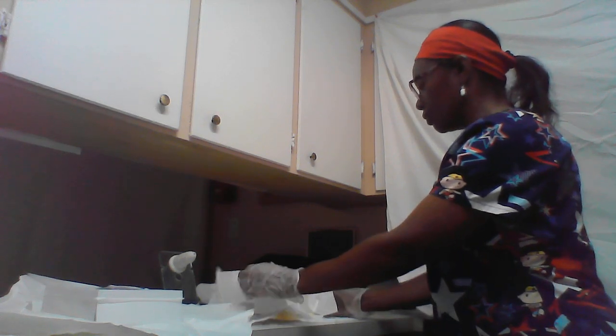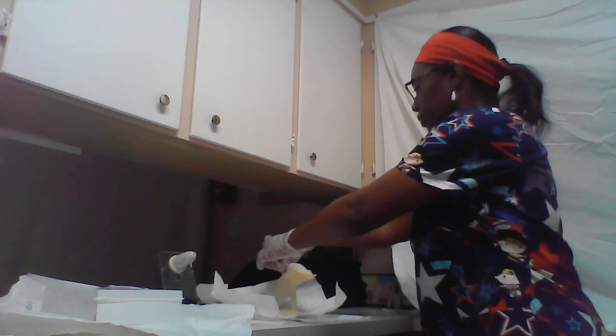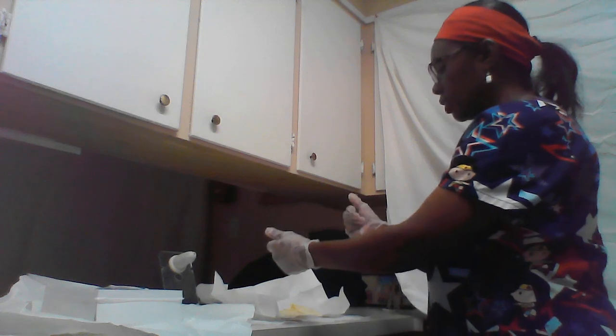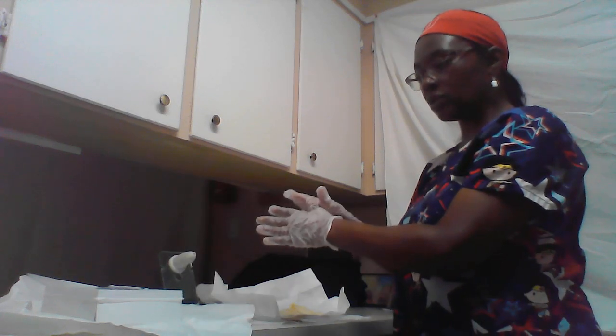And pinch it. And then I'm going to start with my dominant hand by catching it under here, applying the right hand, dominant hand first, and then next I'm going to put the non-dominant hand on, and then I'm going to get my supplies, still having sterile gloves on. I'm going to get the supplies prepared.